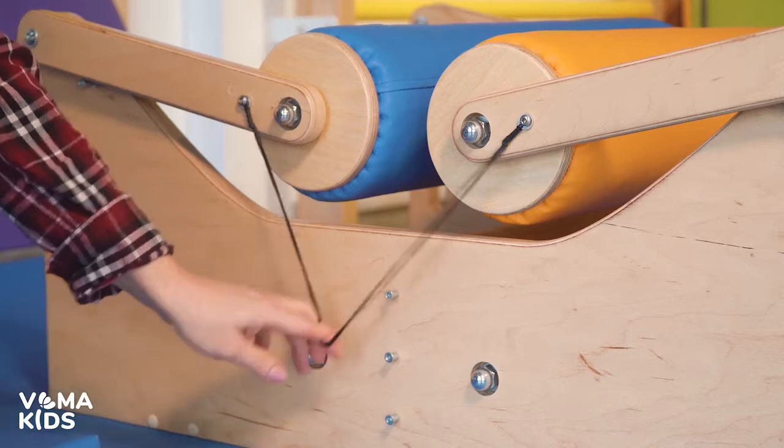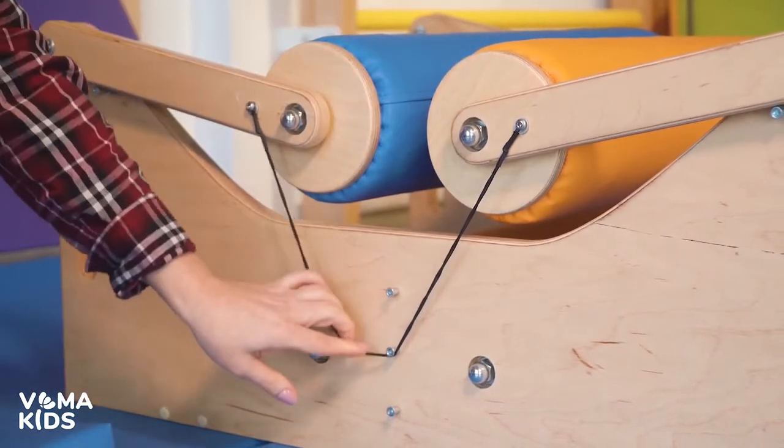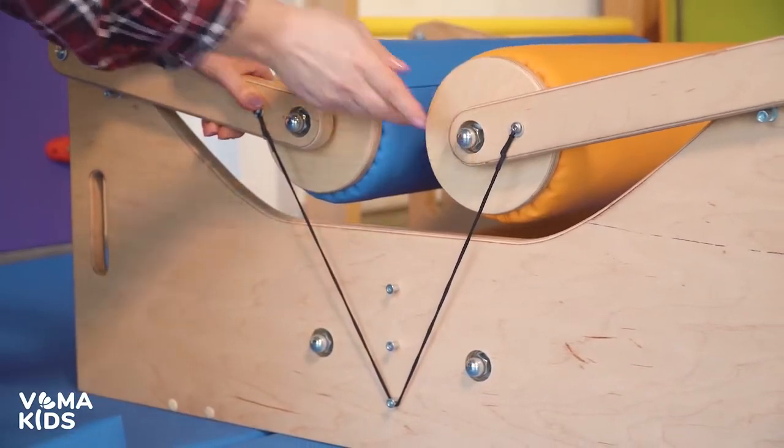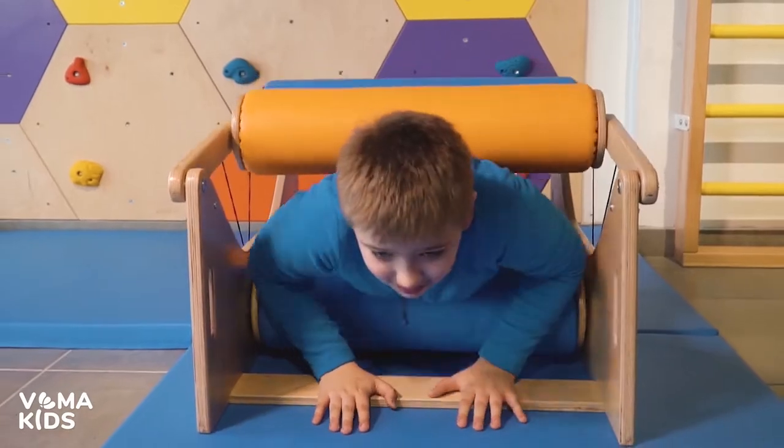All rollers rotate, allowing the child to plunge into this space and feel massage movements that resemble a hug. The rollers adjust to the shape of the child's body while creating a comfortable tension that is suitable even for hypersensitive children.